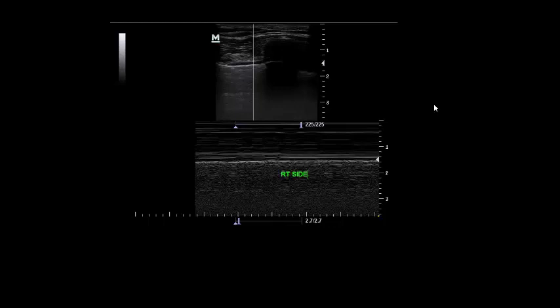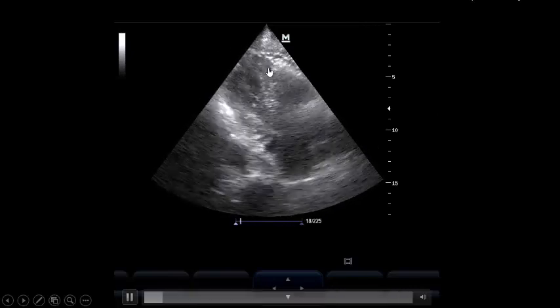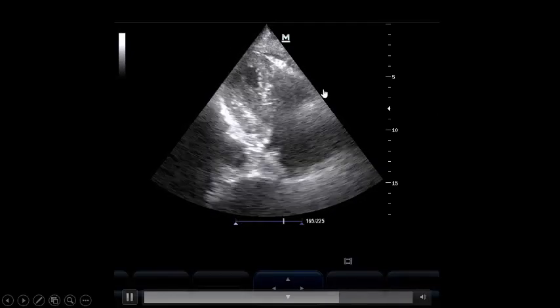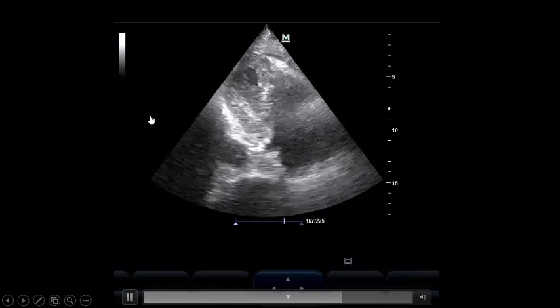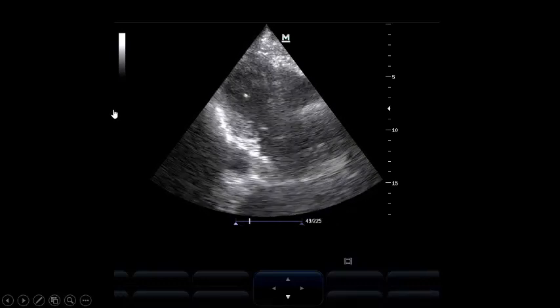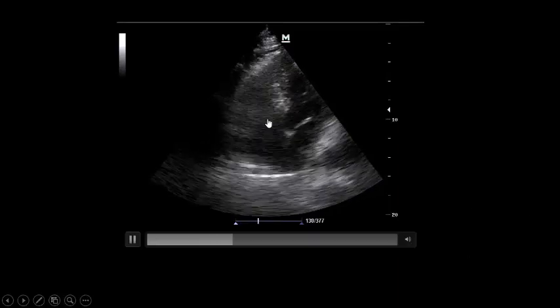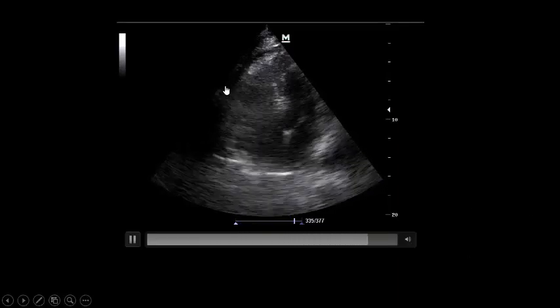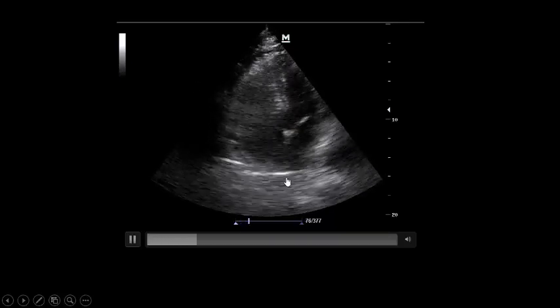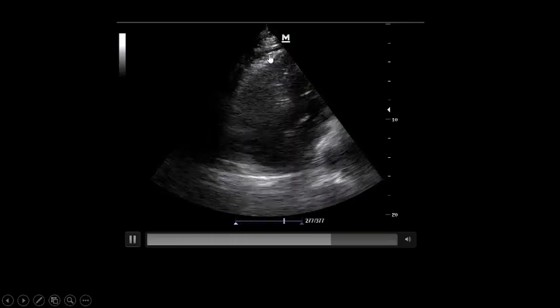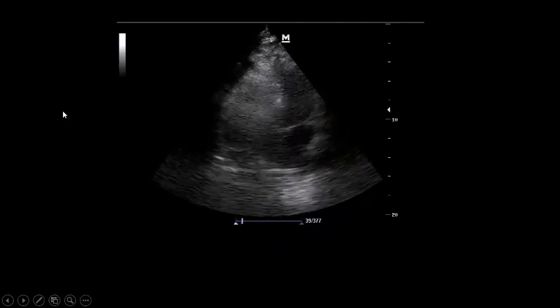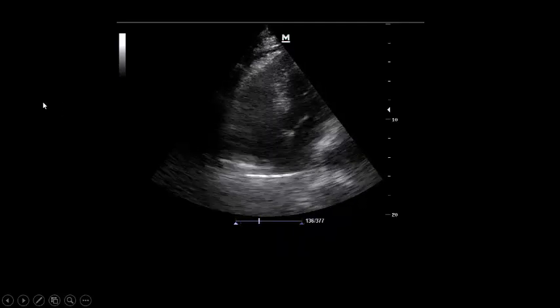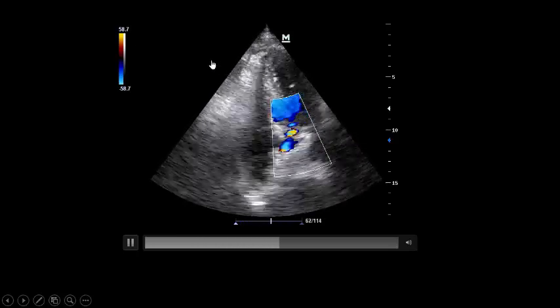We go to the heart to look for new wall motion abnormality, worsening ejection fraction, or right-side ballooning. On the parasternal long-axis view, you can see the right side increasing in size and compressing the left side. In the four-chamber view: horrible ballooning of the right side — this was not the case before mechanical ventilation — compressing the left ventricle. This is acute cor pulmonale that happened with mechanical ventilation.